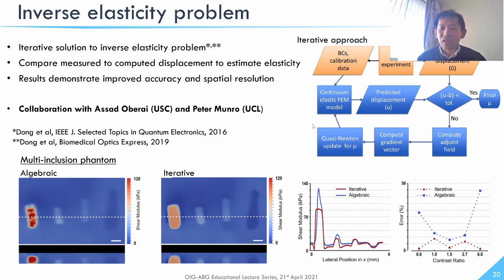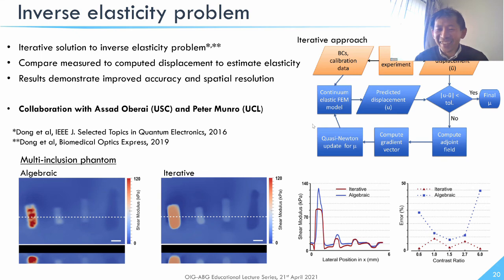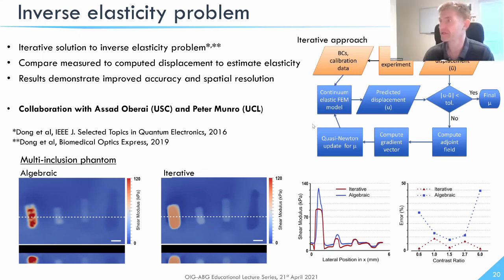Yeah, sort of. Maybe I'll take the last question first. Certainly from our study, it implies that QME is better, but that was a fairly small study. It was 90 patients in total. It was on the excised specimen, and we were looking at specific regions of the tissue. So if we start to roll this out to be used on any specimen at any time, I think you want to have all the information you can have.